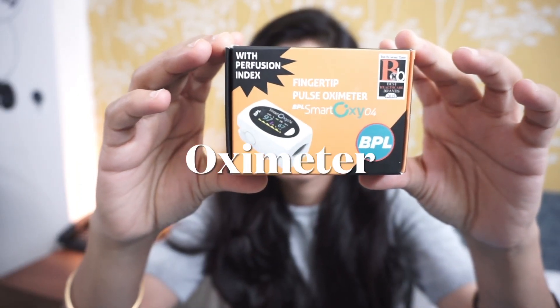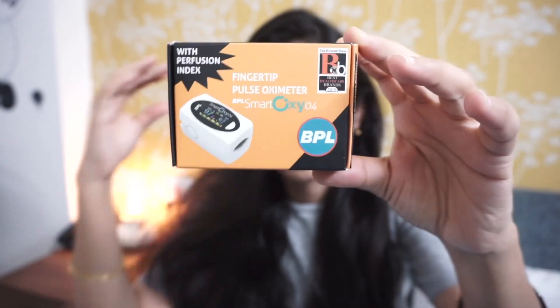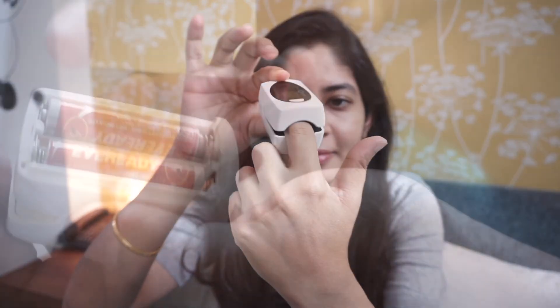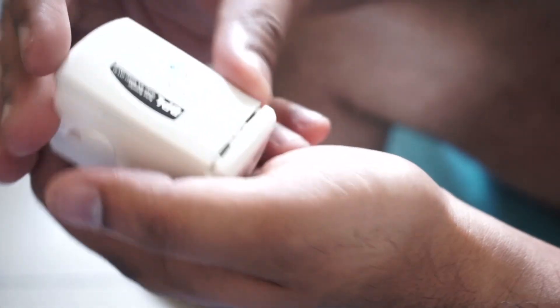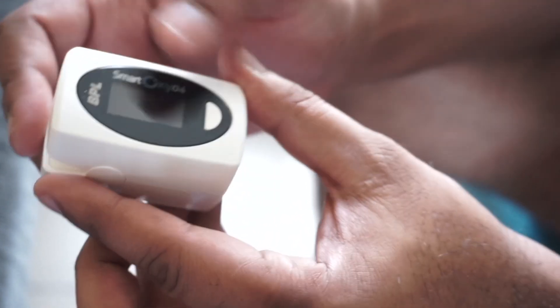The next one is this oximeter from the brand BPL. I had purchased this during the COVID time. This is not a necessity, but you can have it in case you want an oximeter. You just have to insert your finger and get the readings. It operates on two batteries.